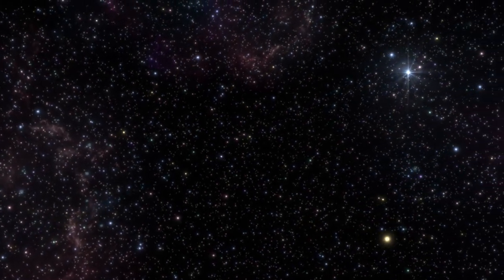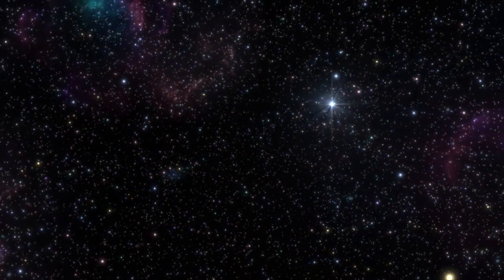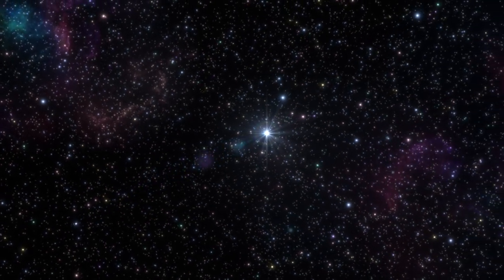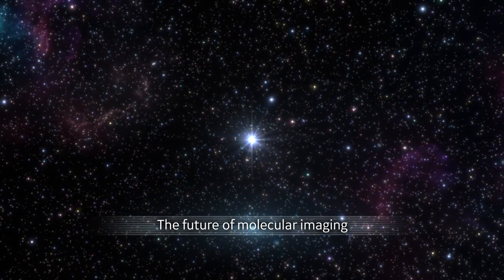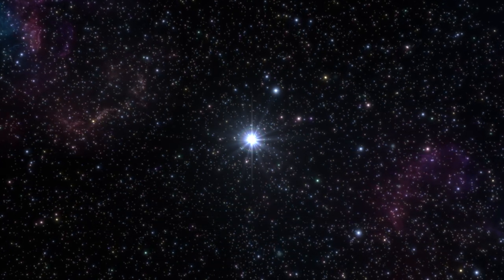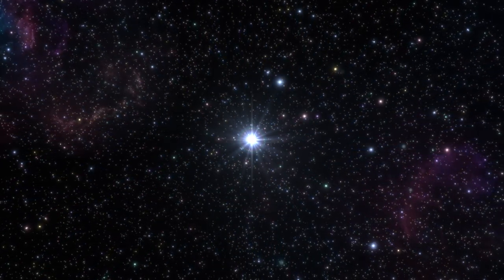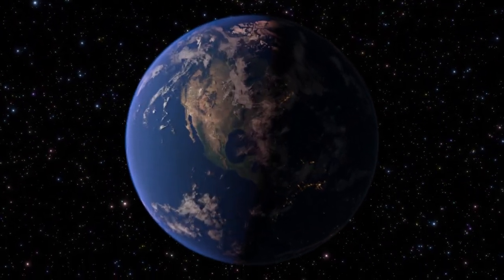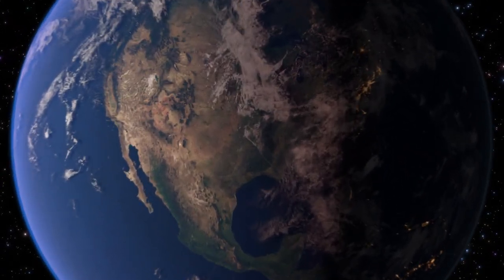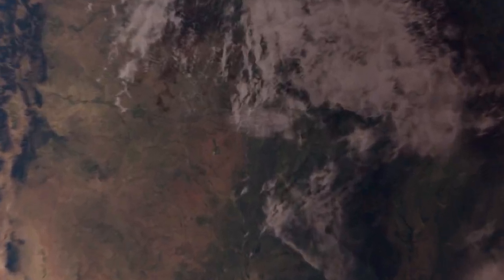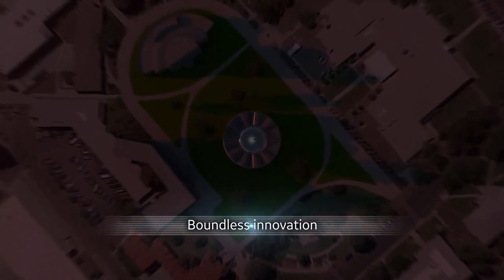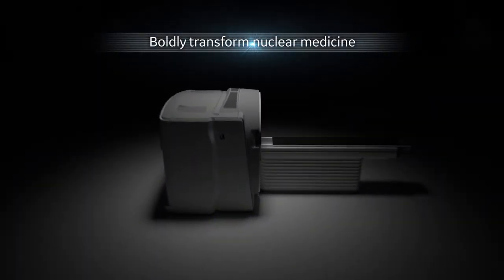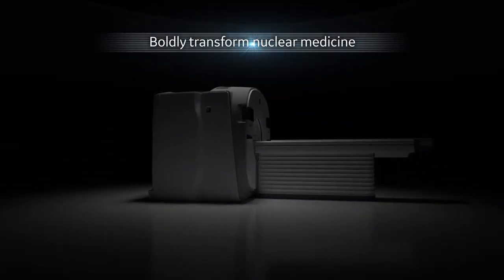Imagine a transformational platform so powerful, it will help shift the future of molecular imaging. A guiding star, leading towards the accelerated speed of tomorrow, forming the frontier for the next generation of healers, the culmination of decades of boundless innovation and focused medical advancement to boldly transform nuclear medicine.